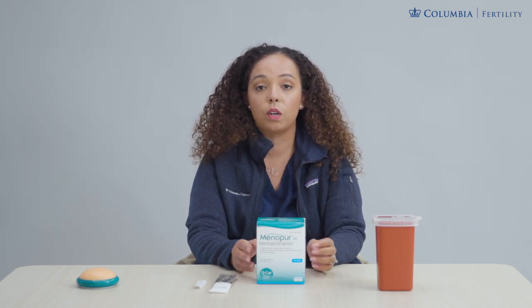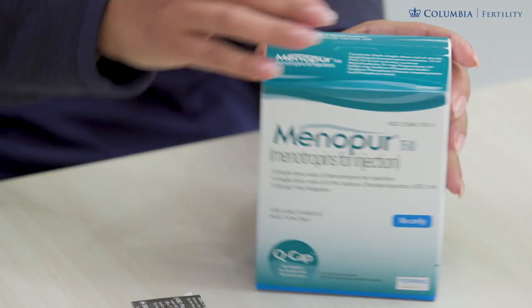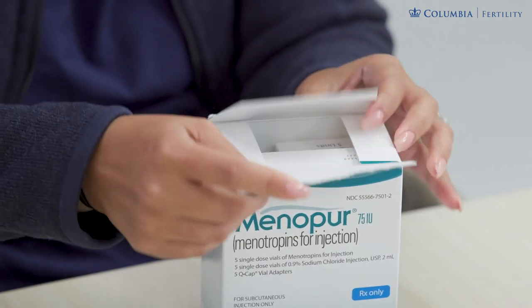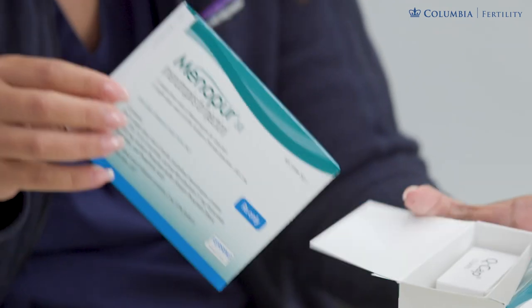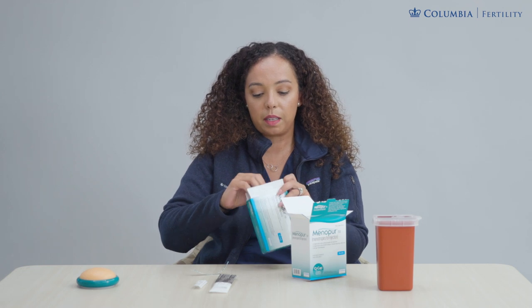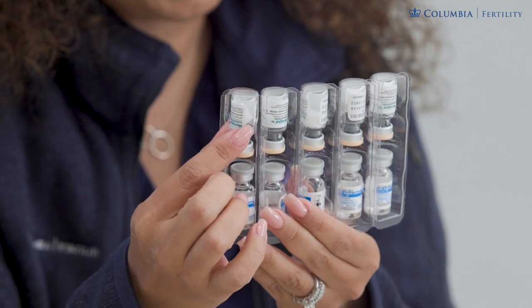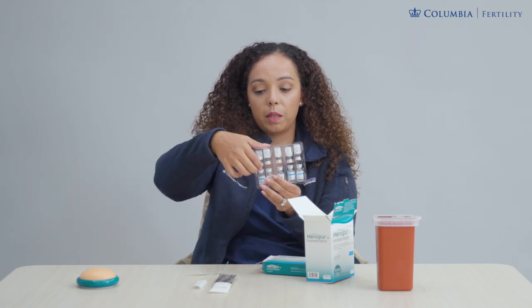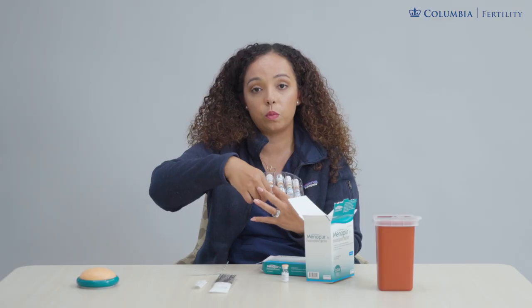The first thing you should do is clean off your surface area and make sure that your hands are cleaned and disinfected. Open up your Menopur box by pulling back the tab and opening up its contents within. You will take out the vials which are within a second box inside of the Menopur box. You do see five liquid vials and five Menopur powder vials. For my dose of one powder vial in the evening, I will need one powder vial and one liquid vial.